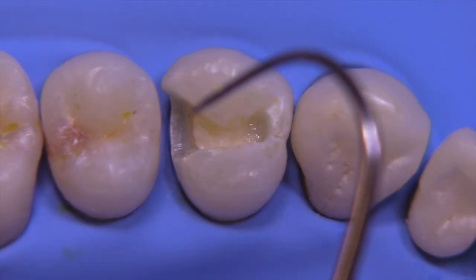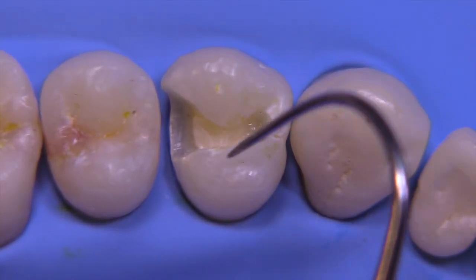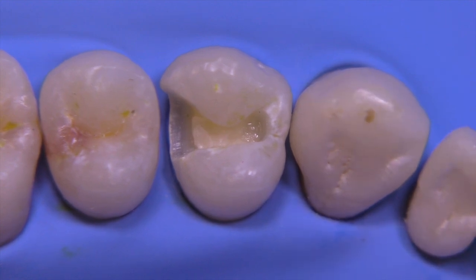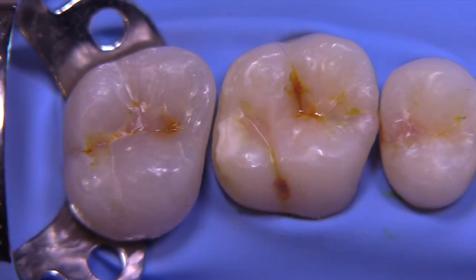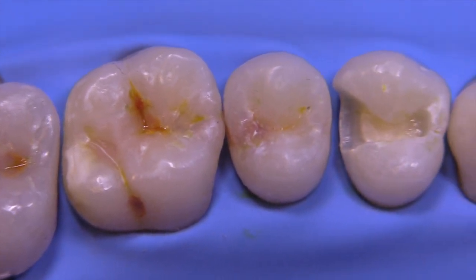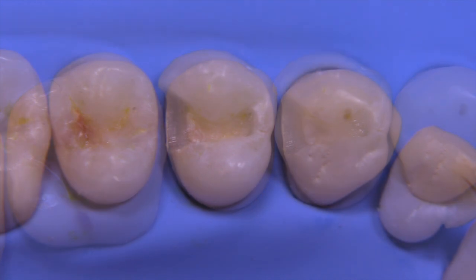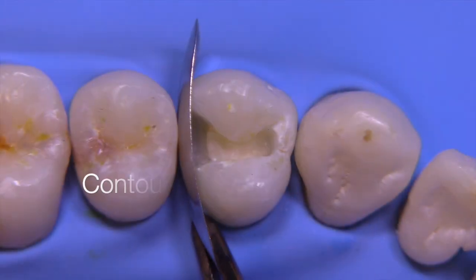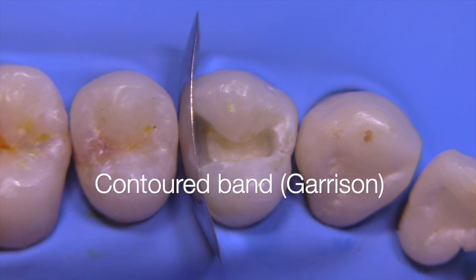We have a DO on tooth number five and it's already been isolated with rubber dam. You can see that the rubber dam is well inverted, and I know that some people advocate the use of floss ties, but I don't find that to be necessary if you invert the rubber dam properly.